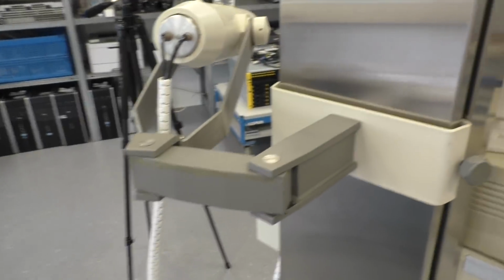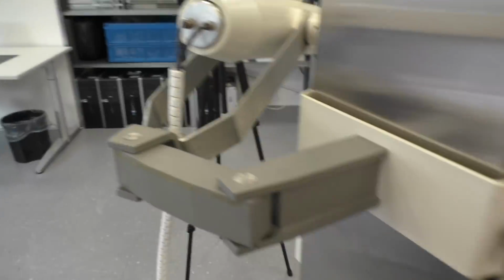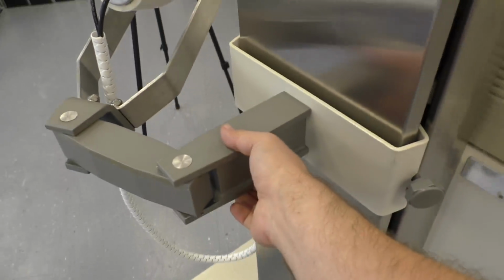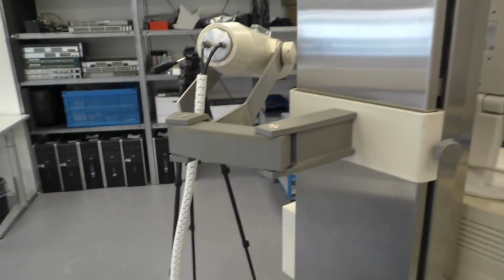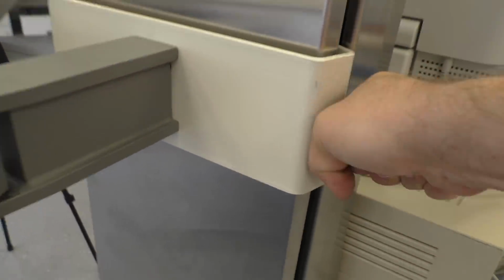And another reason why this unit is so heavy is because there is the heavy lead-filled cylinder here, and here we have a lift mechanism which has counterweights inside. You can see the steel cable here going up and down. Where is it? There it is. And of course the counterweight must have the same weight as this tube assembly. There is a screw to fixate everything.